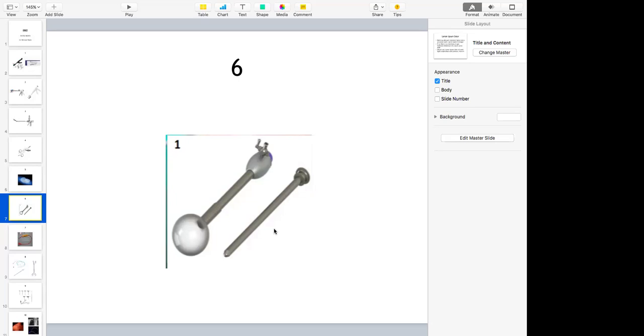You can use 2% glutaraldehyde. So what time is required for sterilization and what time is required for disinfection? Questions like this will be asked in OSCE, very specific. Glutaraldehyde, if you keep it for 20 to 30 minutes, there will be disinfection.